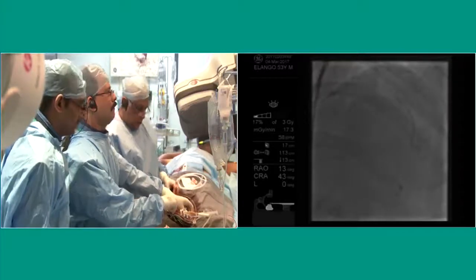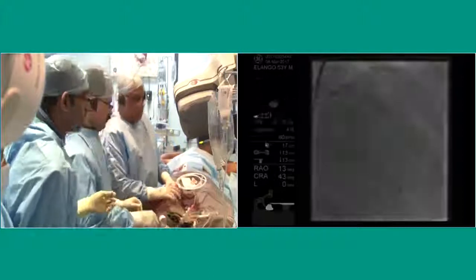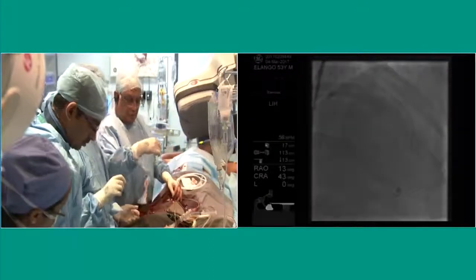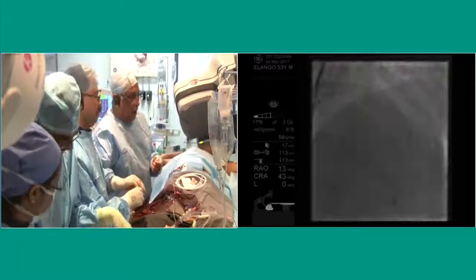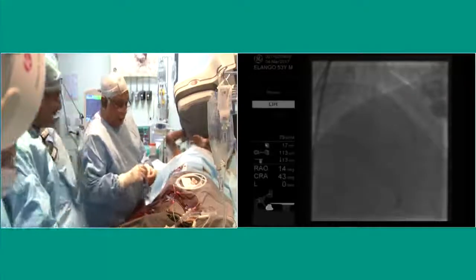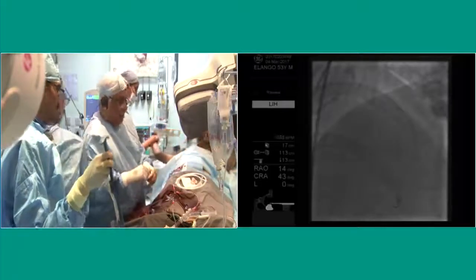It's gone, yeah. Ah, there you are. Now, we managed, and give me the other balloon. And so, Mathew, we're now going to go off air. We've seen you do that. Yep, I know from here on, everything is going to be good. You're actually going to implant this. We managed to get the stent in. Do a lovely tap and do a proximal, and the vessel will look good.